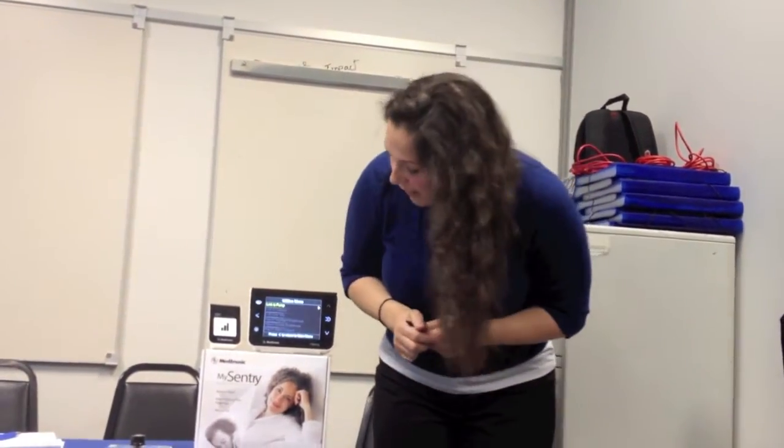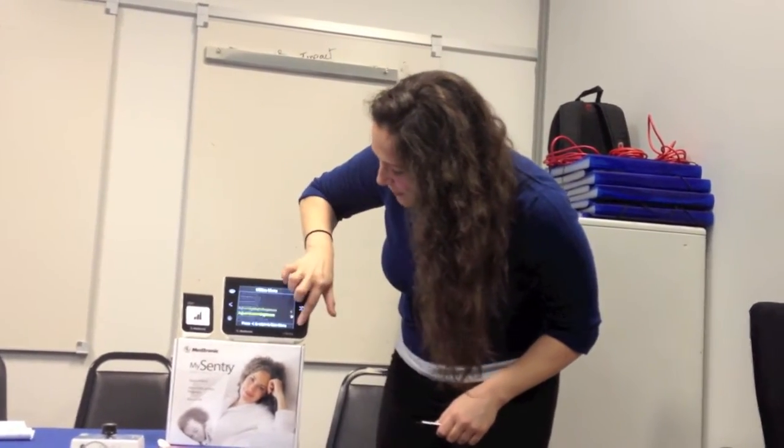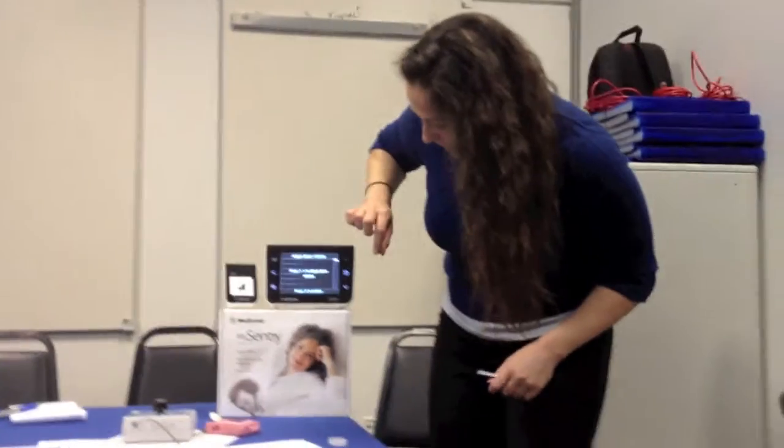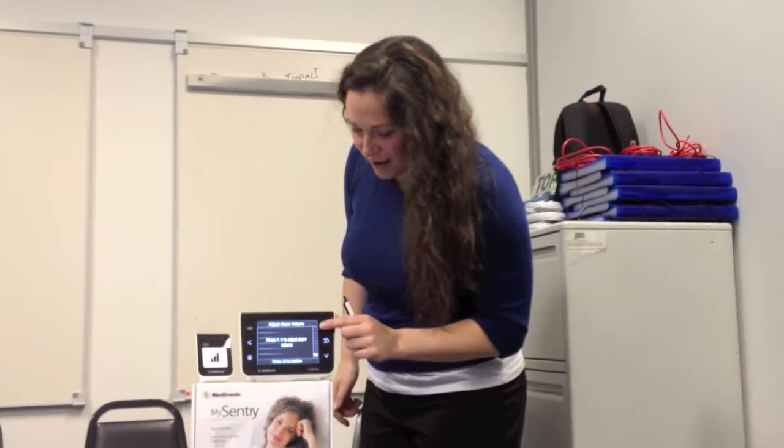You can also adjust the screen brightness. Understanding that it's nighttime and you're sleeping, you may want to adjust that screen brightness down and make sure it's not as bright. And then finally, you can adjust the alarm volume, which I know is the big winner here. That's what everyone's most excited about. So we'll go through, and I'll show you guys what that can sound like. So that's the lowest volume. Maybe for those light sleepers, those people who, as Greg said, can't sleep by the train tracks. Everything just stirs them.